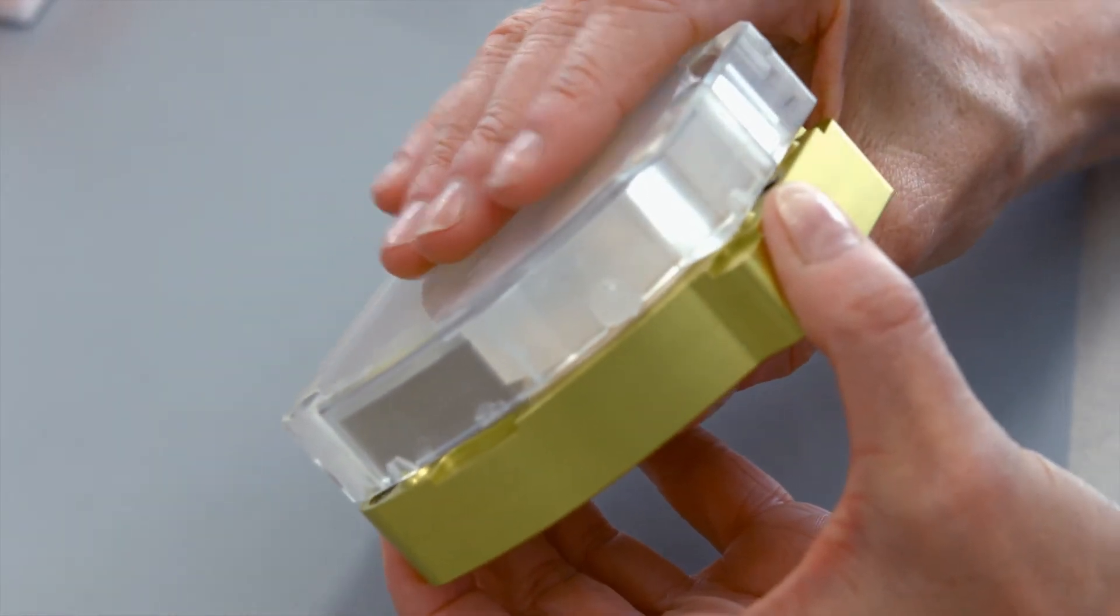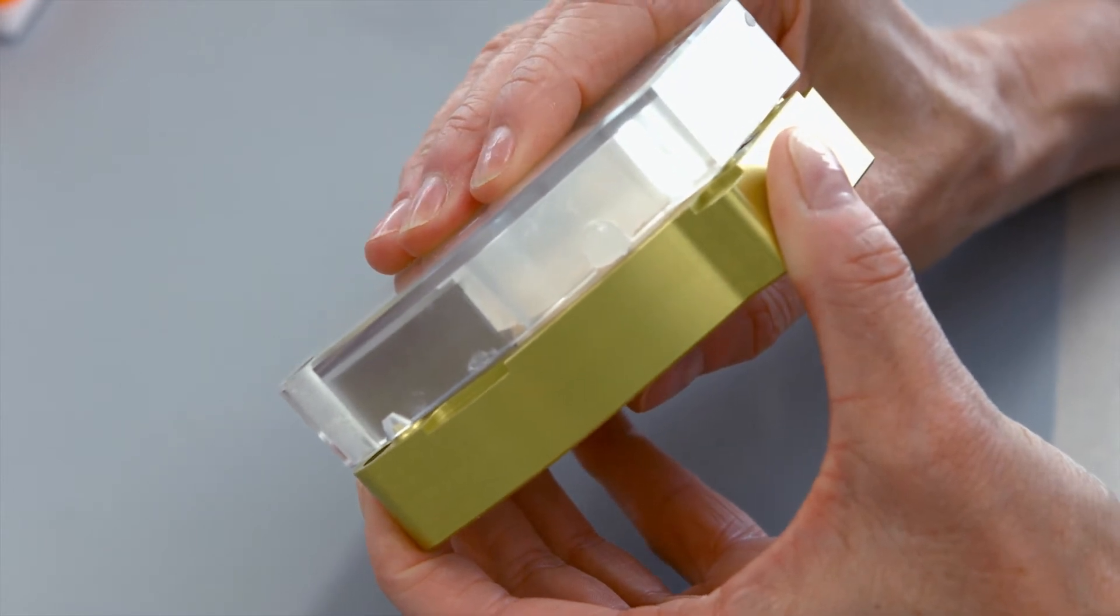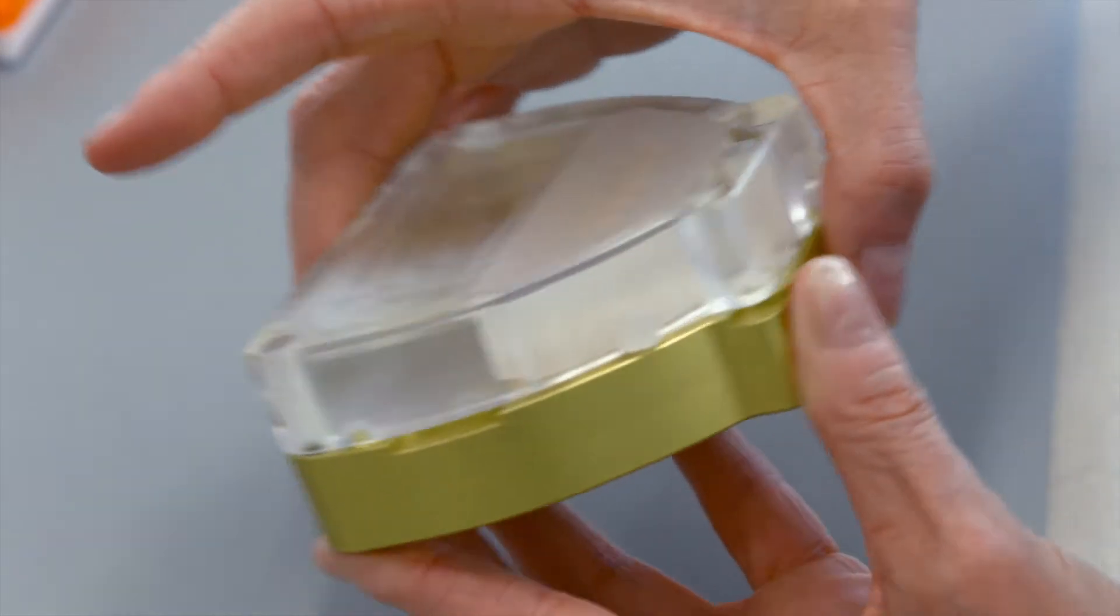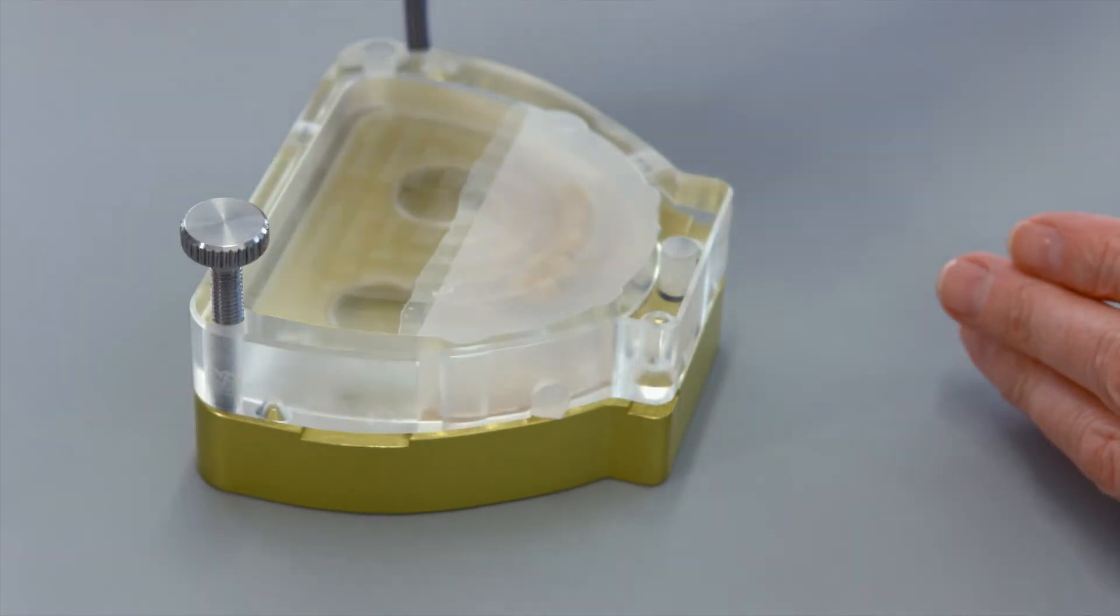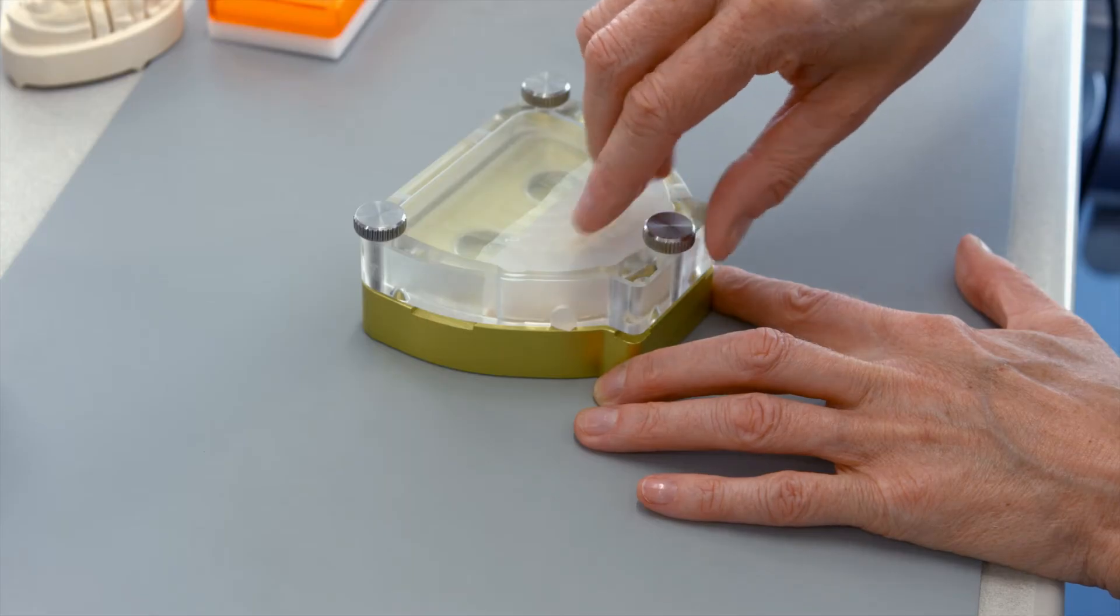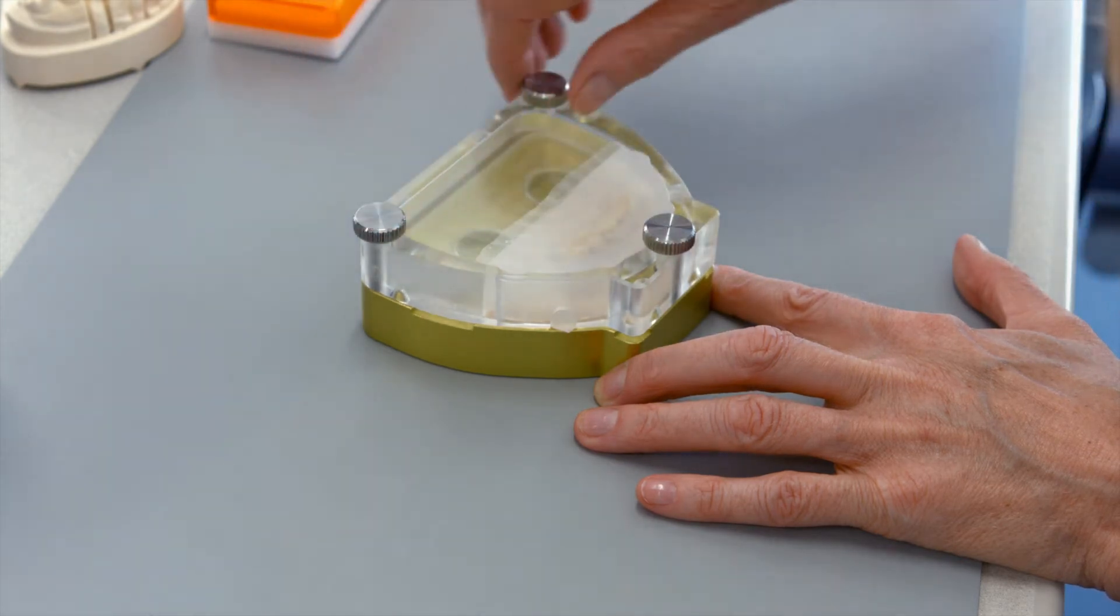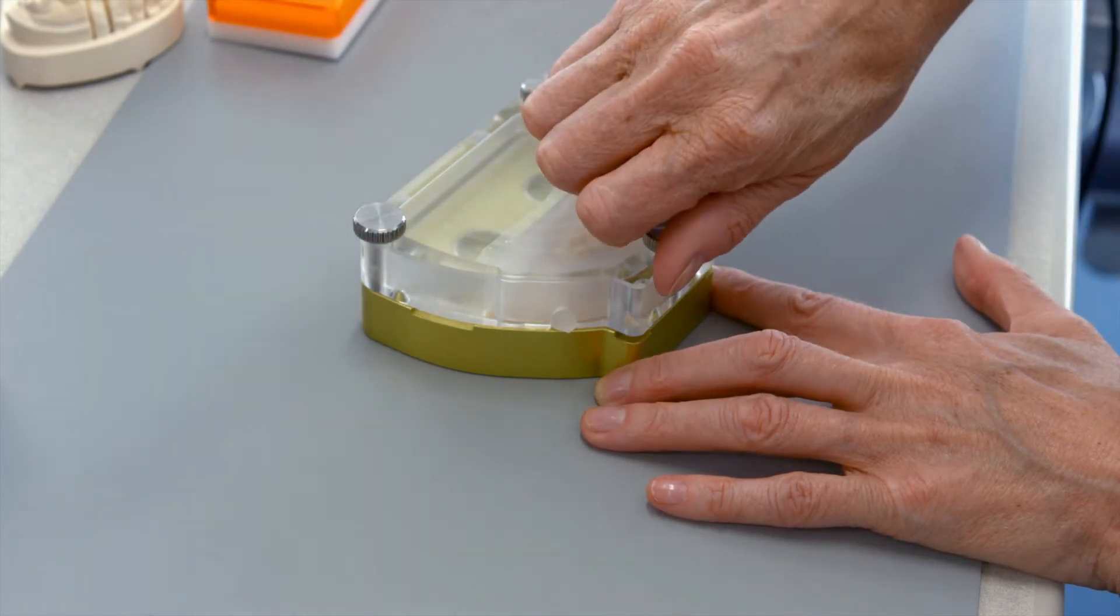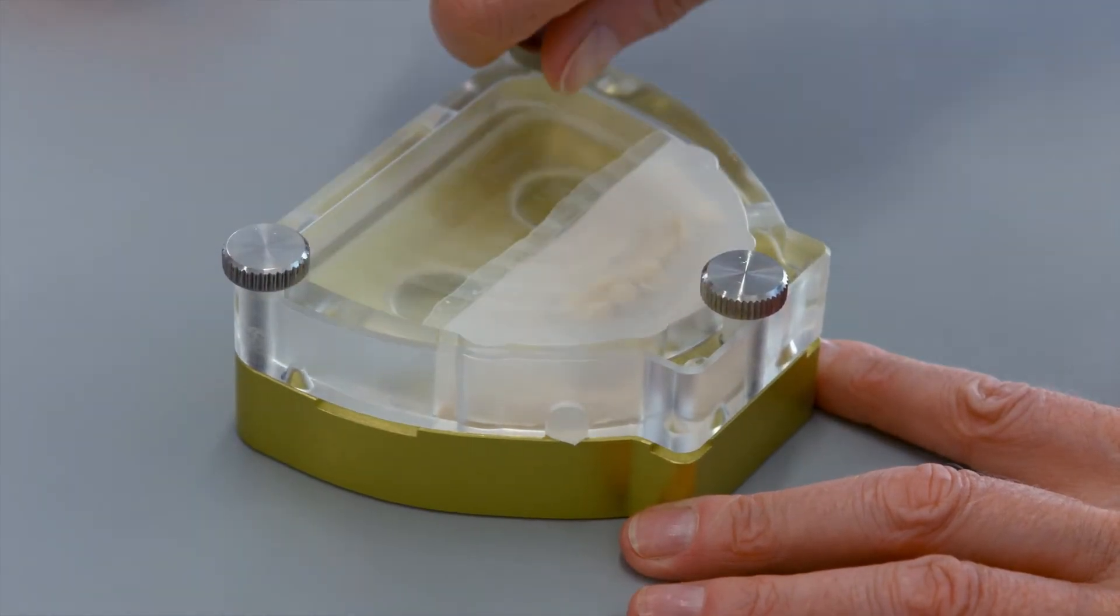Join the two flask halves and adjust them until you feel a perceptible resistance. Close the flask with the three screws provided. Insert the screws into the designated holes. Give each screw one to two clockwise turns, alternating between screws until a gap of one to two millimeters remains between the flask halves. Then tighten all three screws completely.